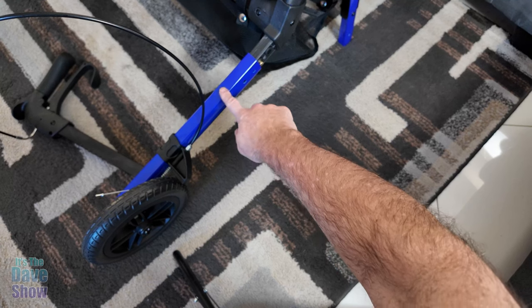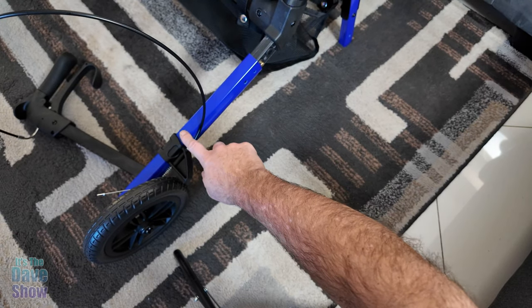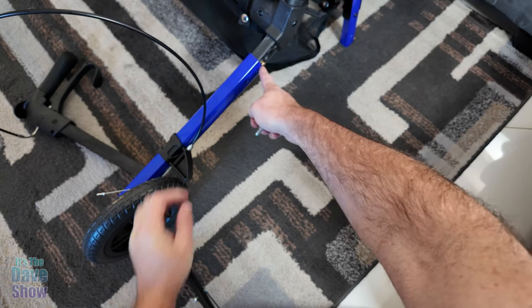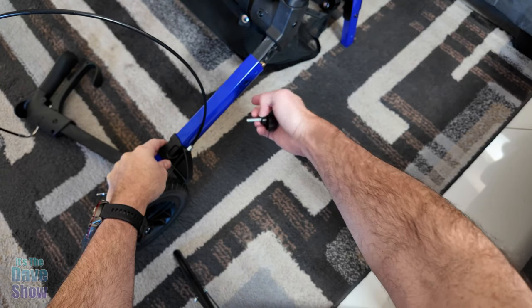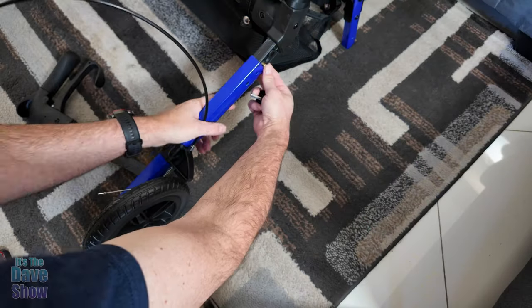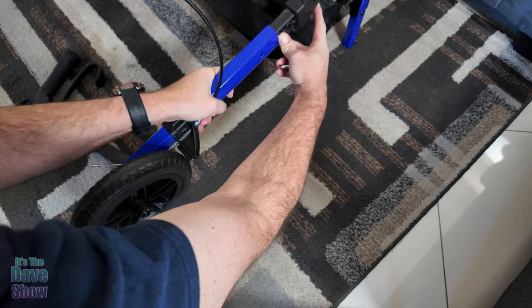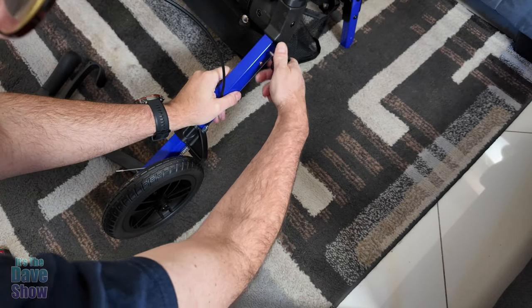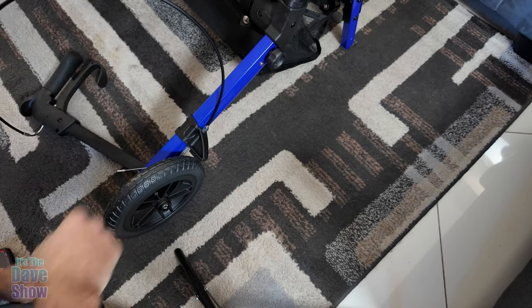First step is to put the legs on. This is the leg with the brake on it. It just attaches in here — there's a little button you press to push it in, and then we put the set screw in. We do that for both sides.